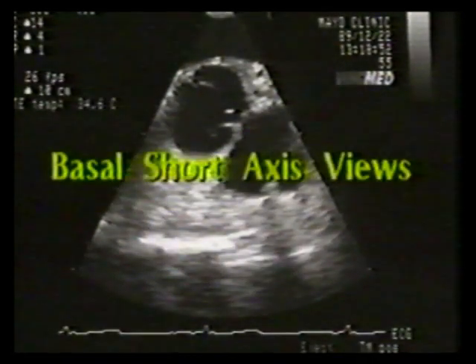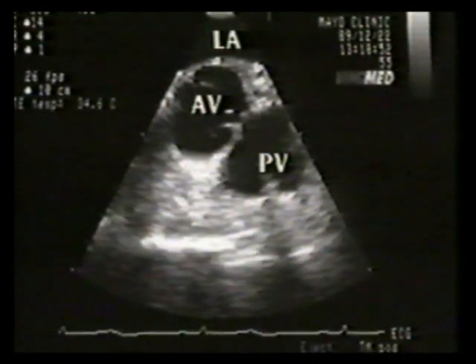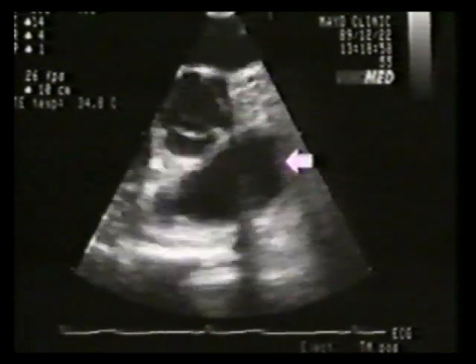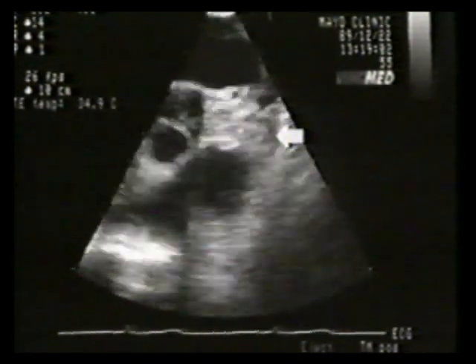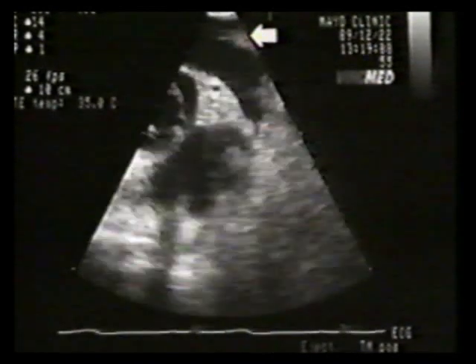This is a transesophageal echocardiogram of a basal short-axis view. The transducer is adjacent to the left atrial cavity. The central structure is the aortic valve, which is usually cut obliquely. To the right of the image is the pulmonary valve. A portion of the left coronary artery is visualized, the left atrial appendage, the left atrial cavity, and lastly, the left upper pulmonary vein.